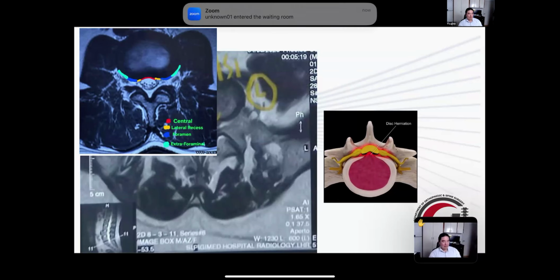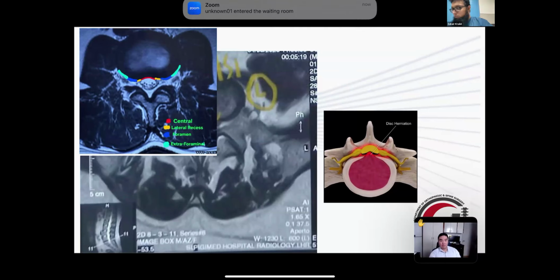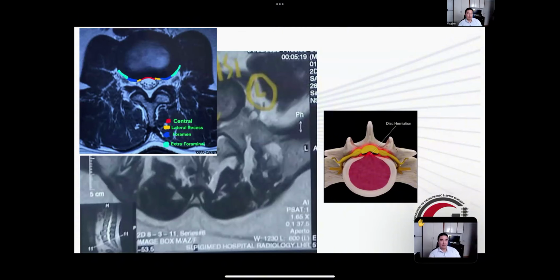When we do a foraminal approach, from my experience, I did some cases, not for intracanal pathologies but for foraminal pathologies, and we have a very high rate of dysesthesia. It is a very bad complication, and it takes 3 to 4 months to resolve. It is not a good experience for the doctor, nor for the patient. Jason, you can also share your thoughts.